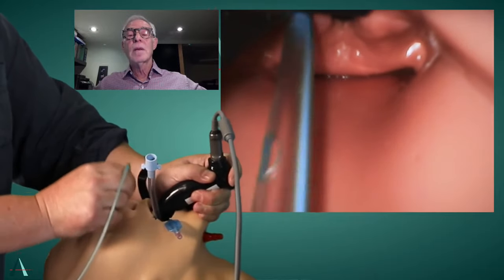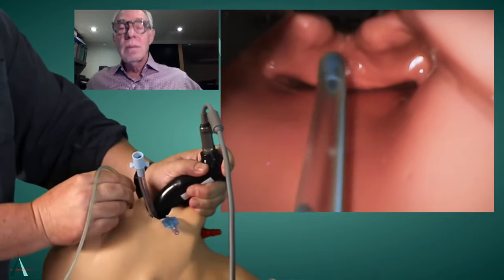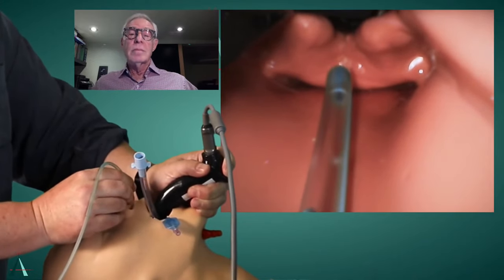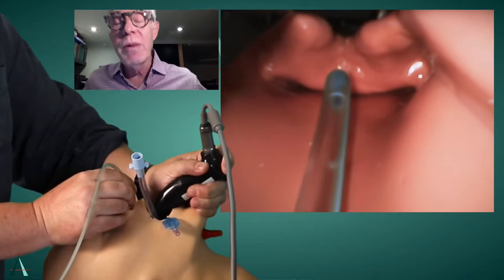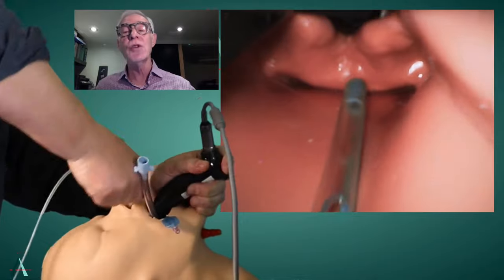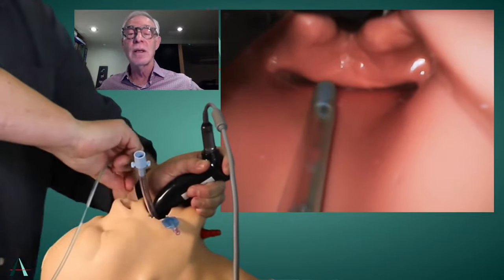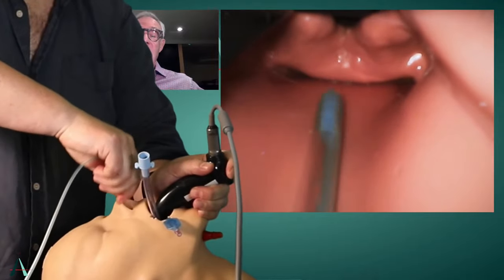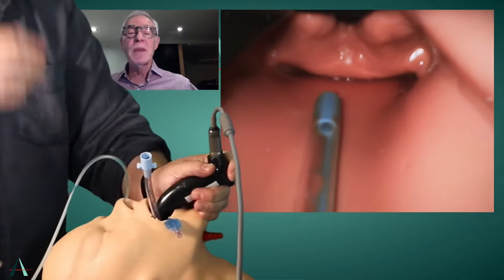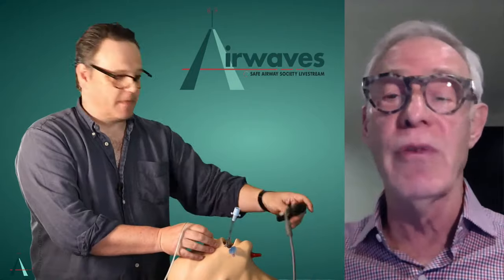If I was able to move that at all, it's very sticky because I haven't put enough lube on it, you would be able to manipulate that now under vision and put it down. So we would try to rotate that 180 degrees and eventually you'll get in, probably to the lateral fornix. But I think the point is made about how that would be useful, Richard. Definitely demonstrate that technique, and it works very effectively.